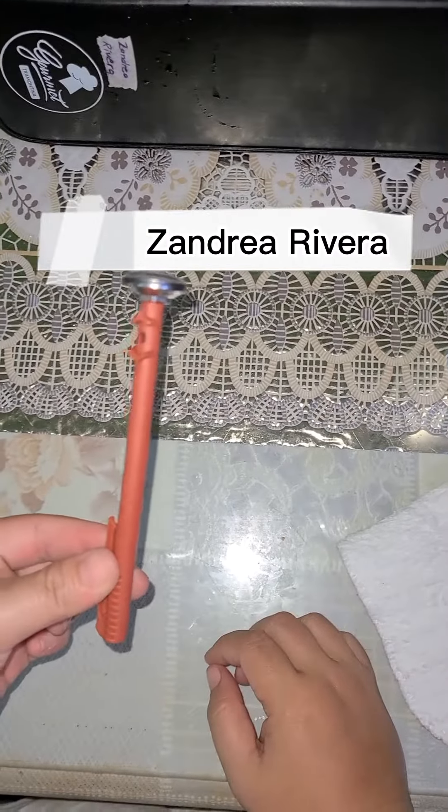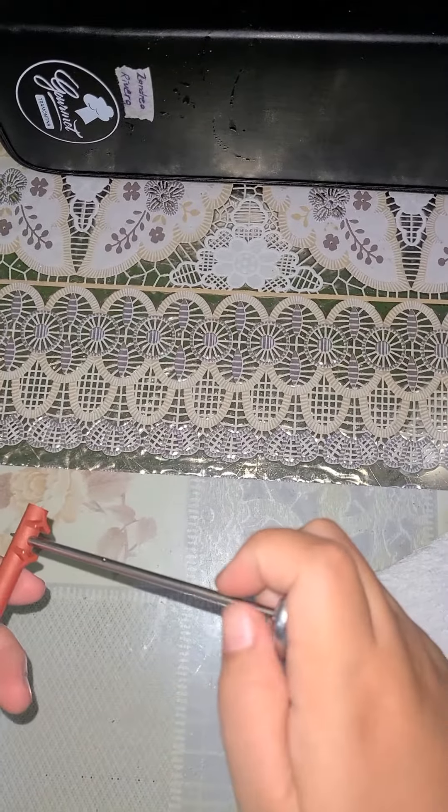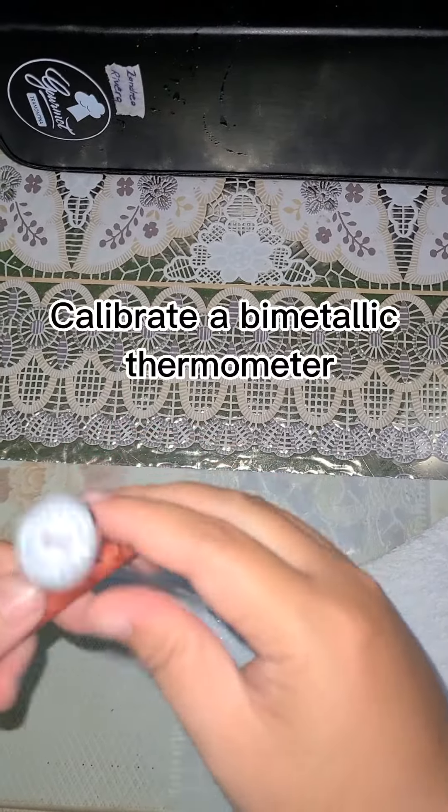Hi, my name is Andrea and in this video, I'm gonna demonstrate to you one of the things I learned from our module, and it is how to calibrate a bimetallic thermometer.